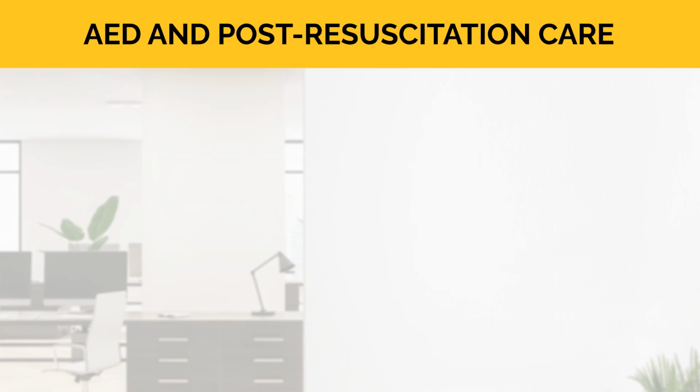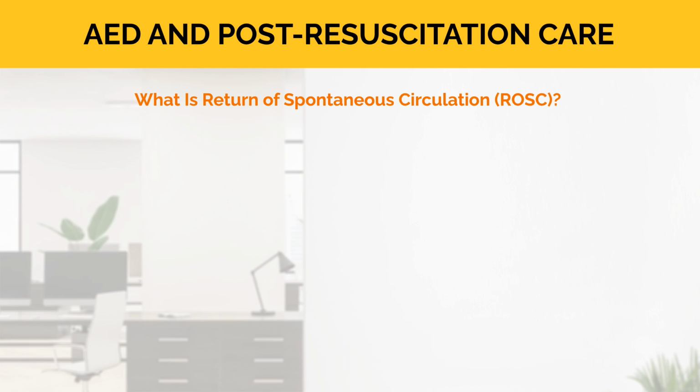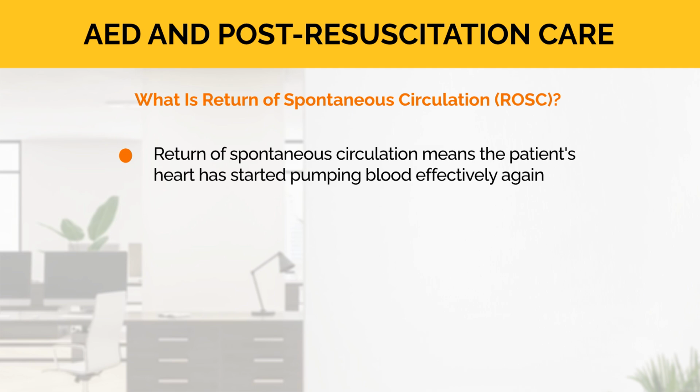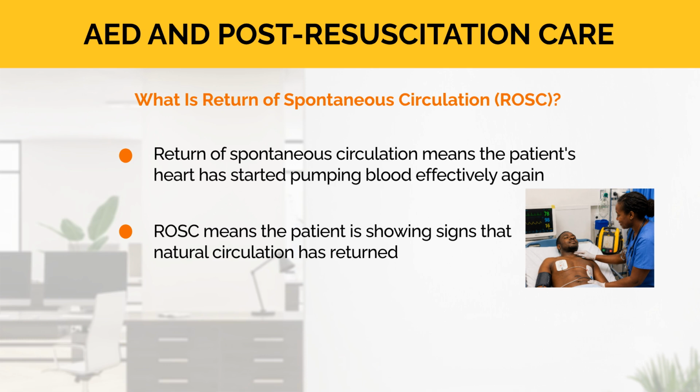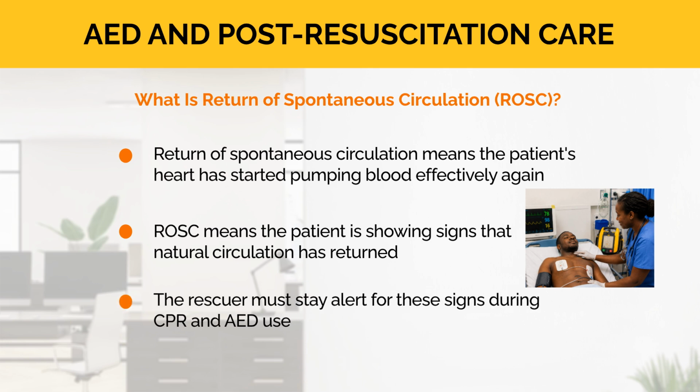Now, let's look at what return of spontaneous circulation, ROSC, is. Return of spontaneous circulation means the patient's heart has started pumping blood effectively again. ROSC means the patient is showing signs that natural circulation has returned. The rescuer must stay alert for these signs during CPR and AED use.